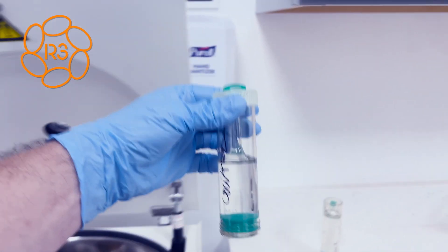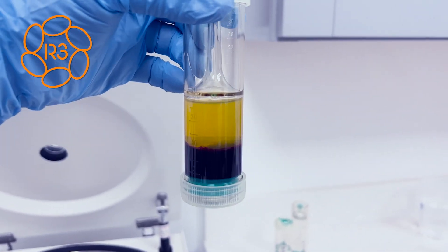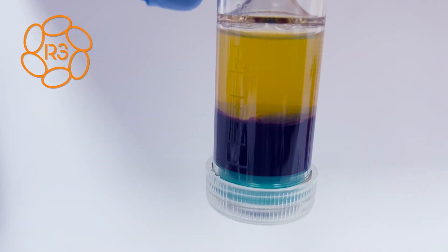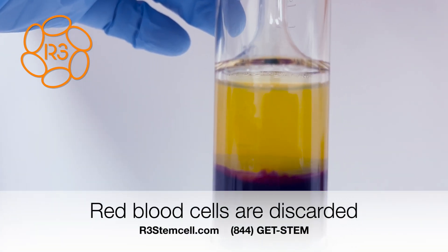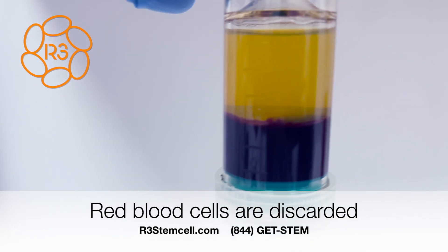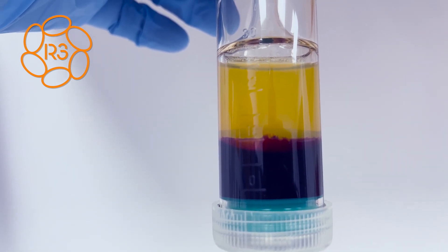Alright, counterbalance. Here's the gentleman's blood — amazing separation. This dark area is the red blood cells, and those fall to the bottom. We do not want those. The top is the PPP and then in the middle is the PRP, so we want that for him. We're going to get ready for the second spin.